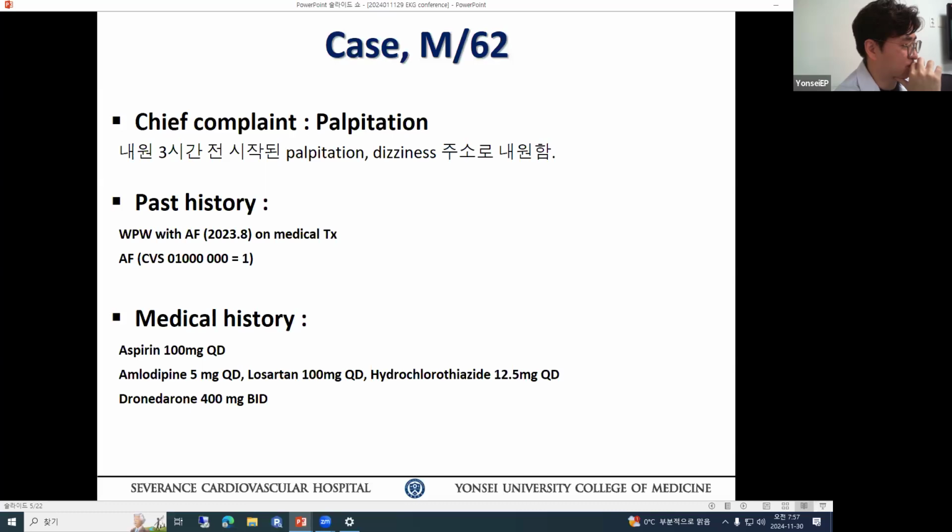There was an old paper: if the patient has both documented atrial fibrillation and WPW, just ablating the bypass tract, 50% of patients never show atrial fibrillation again. But it was a very, very old paper, and we still don't have a systematic long-term follow-up study for those patients. I leave the atrial fibrillation and follow closely, as Dr. Yu did, and I eventually saw documented atrial fibrillation from time to time.